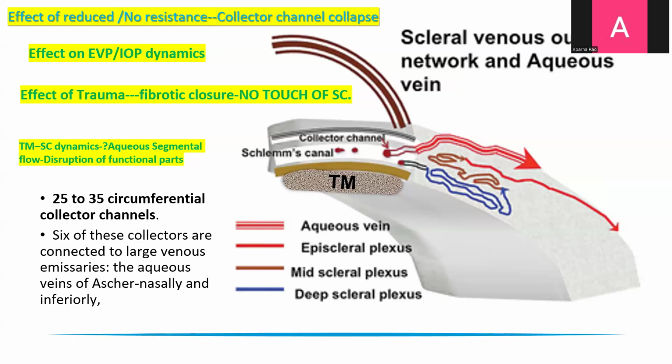Additionally, we should be aware of the potential trauma from forceful gripping of the trabecular meshwork, passage of a suture or microcatheter, which can cause bleeding and recruit fibroblasts into the region, potentially leading to closure of the mouths of existing collector channels in that area despite a successful surgery.